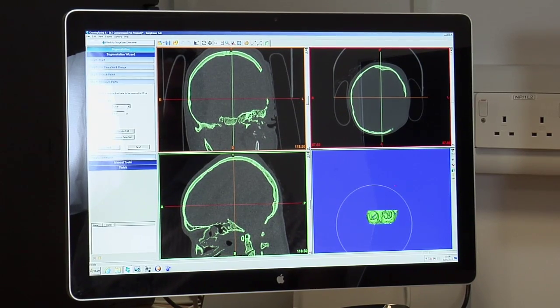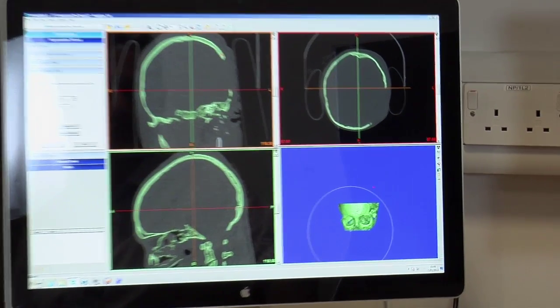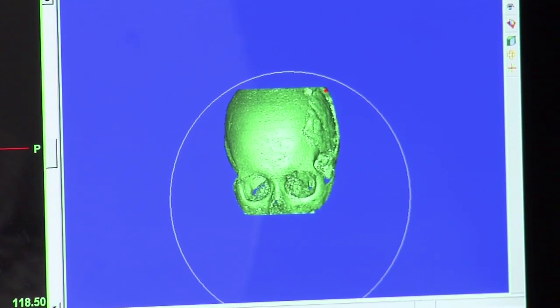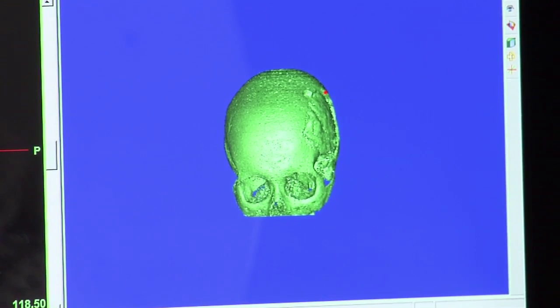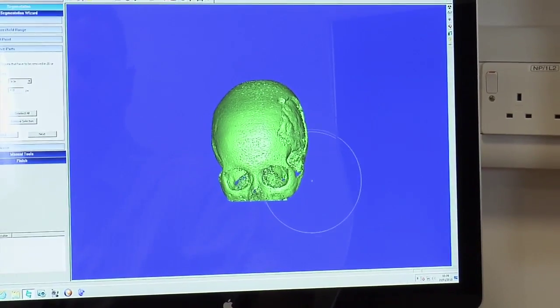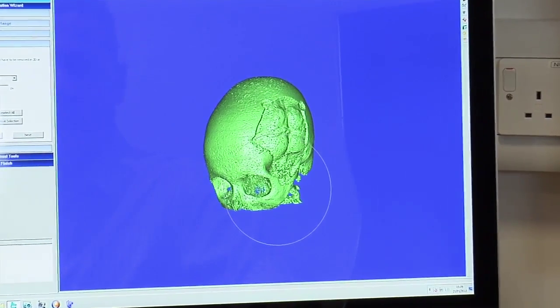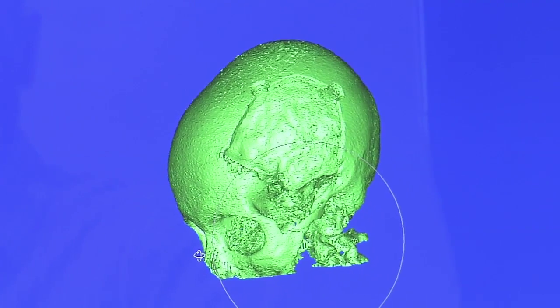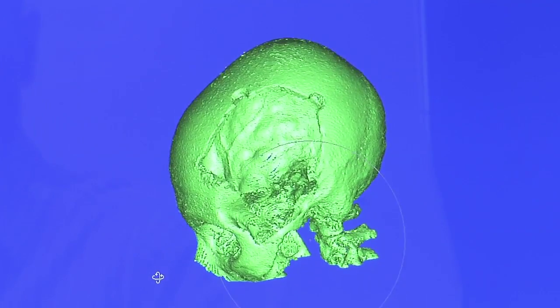As you can see on the bottom right square, the 3D image is slowly coming into view. We can zoom onto full screen. As you can see, this is the 3D image of the skull.